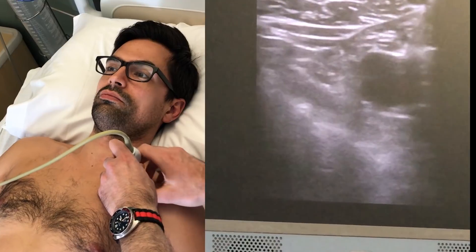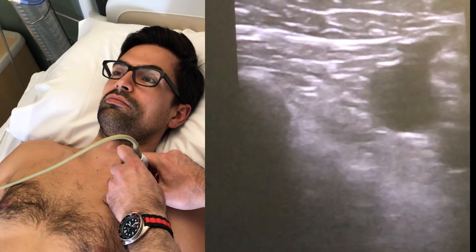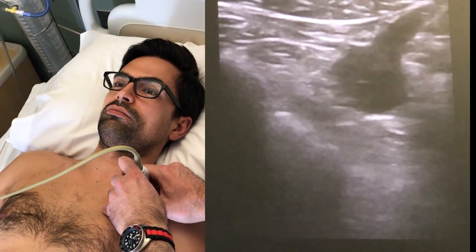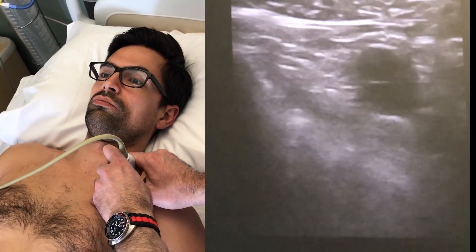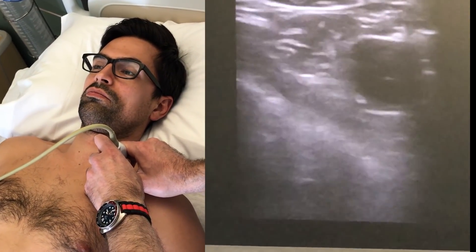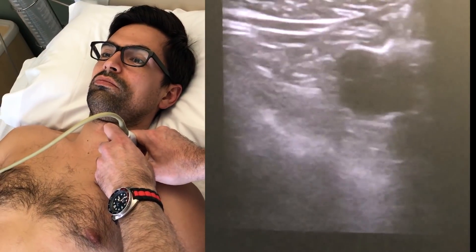There you can see this is the subclavian vein, but beneath it you can actually get the sense that there's a little bit of lung sliding there. This is relatively close to the pleural line, not necessarily the greatest place to do a procedure. As we go more medial, we can still see the lung slide there kind of behind it, and then the clavicle is cutting us off. So in a neutral position, this wouldn't necessarily be the greatest procedure to do.